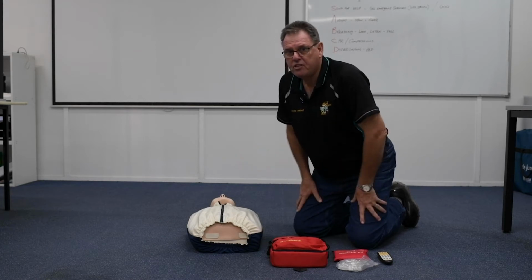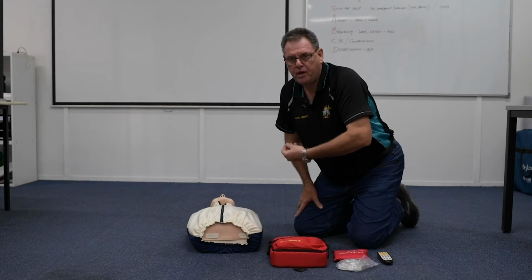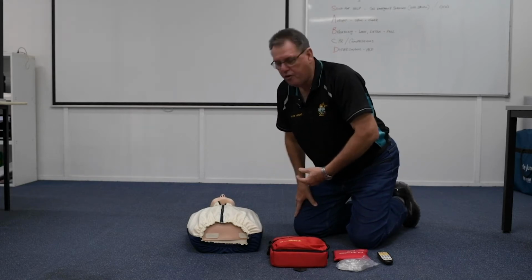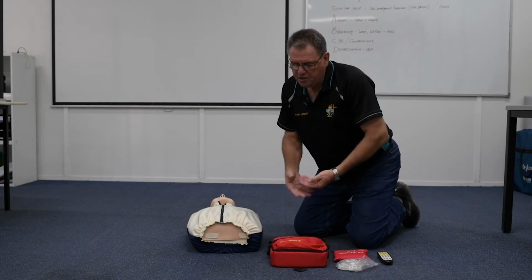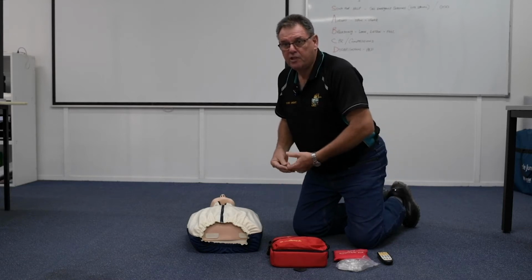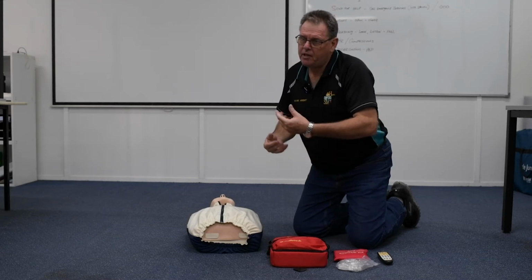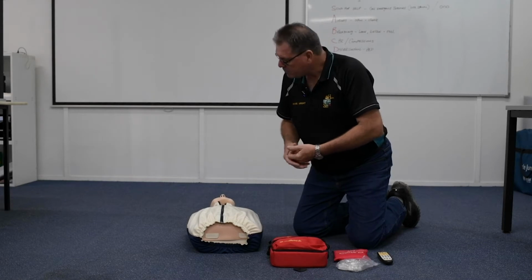Some of the safety features that we need to consider here is that we're not moving the patient, we're not in contact with the patient, and we're not in an explosive environment when we're using the AED. One of the first things that the AED is going to ask us is to send for help. So we've already done that. In a previous video, we discussed the action plan of first aid, your primary survey.